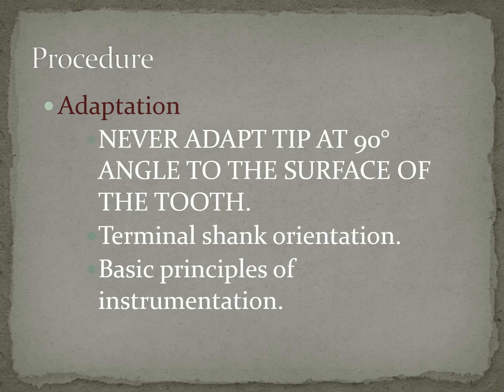So remember we said that the power is the highest at this very end, the 2 to 3 millimeters at the end. So we never adapt that tip at a 90-degree angle to the tooth surface. Okay, so that very tip is the most active. So we are not going to ever put that against the tooth. So never adapt the tip at a 90-degree.